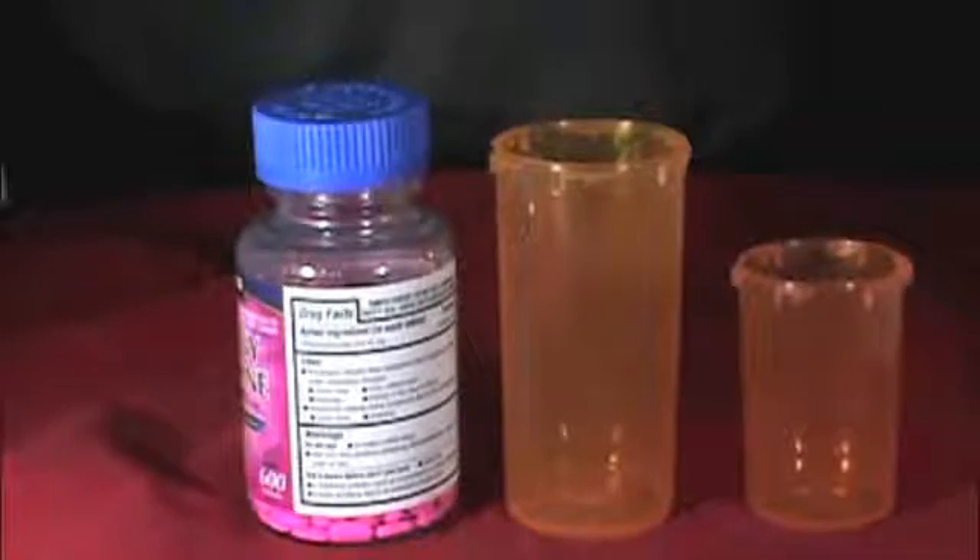In this video, we are going to demonstrate using the Jorvet CountRight pill counter to count the number of pills in a stock container for inventory purposes.